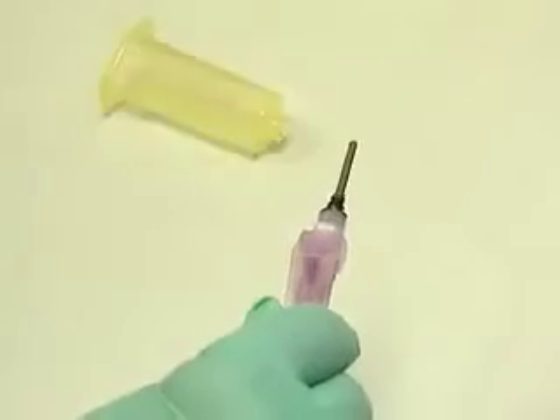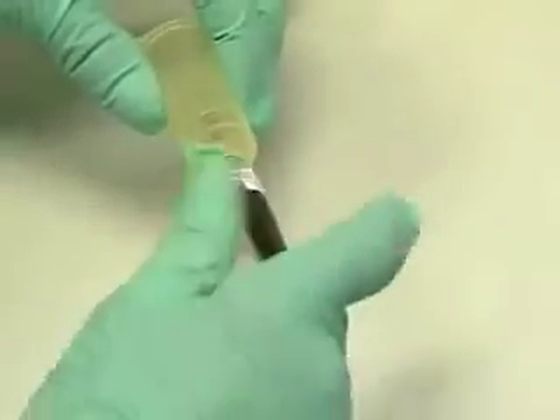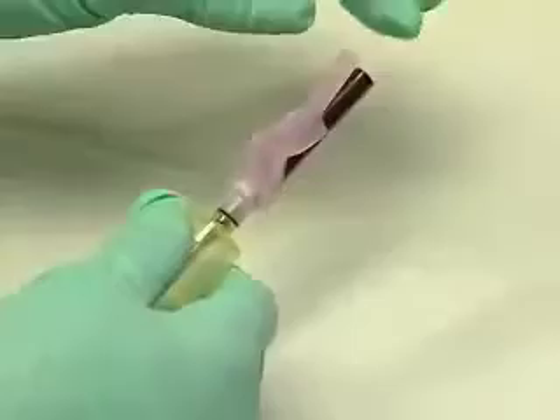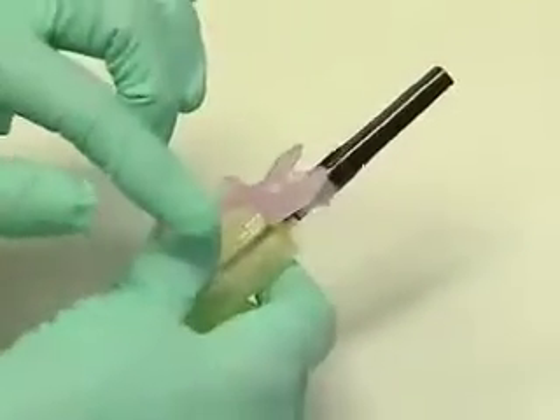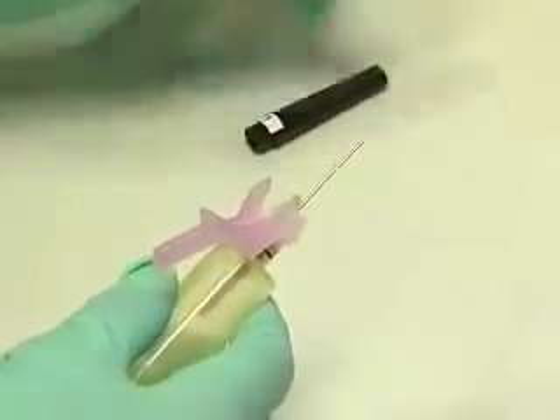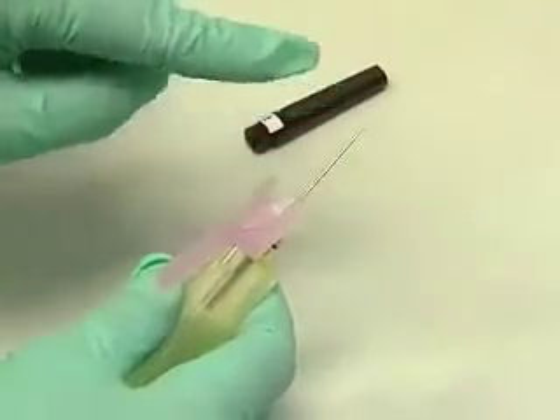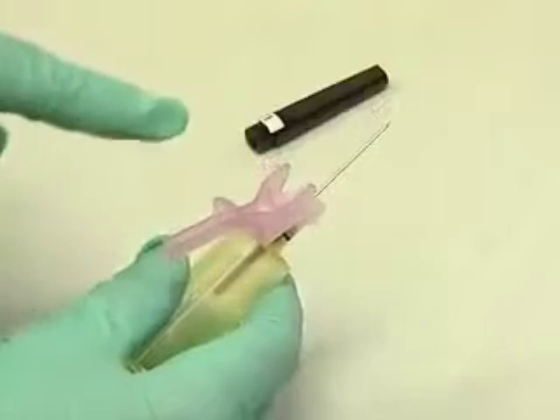Carefully remove the cap to unsheathe the needle and insert it into the yellow vacutainer, screwing it into place. Then lift the needle guard and remove the cap. You'll see that the hole in the beveled edge of the needle is facing up and is in line with the needle guard.